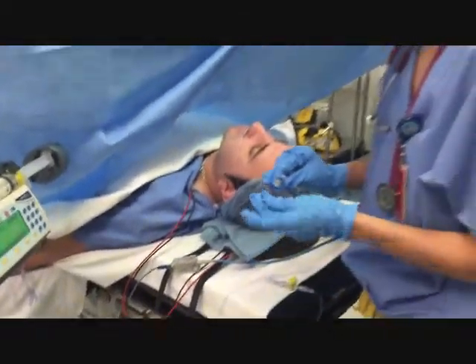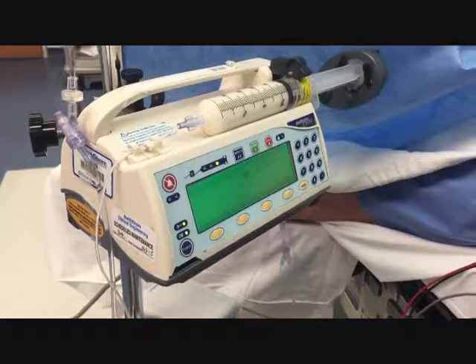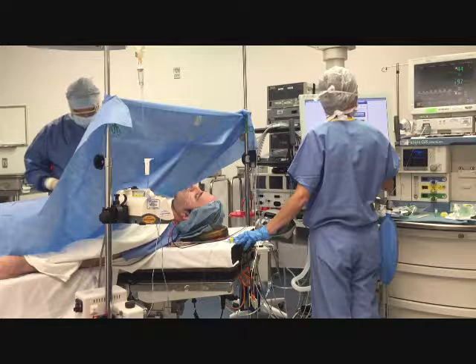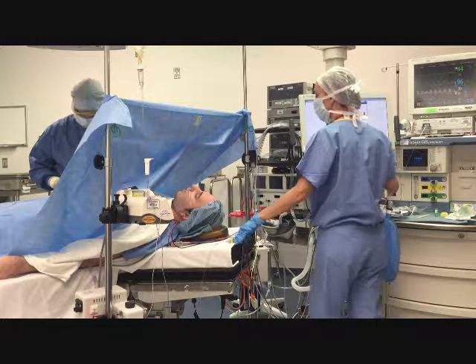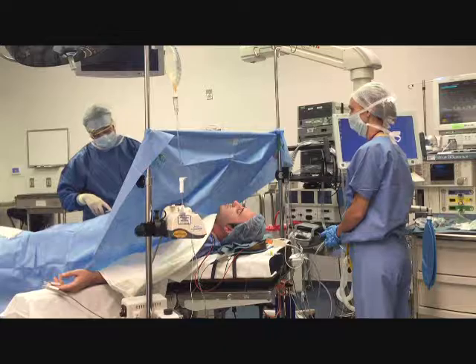An additional 50 mics of fentanyl has been given and a propofol drip is infusing at 75 mics per kg per minute. The surgeon makes incision without much response from the patient. He is occasionally lightly snoring with dampening of end-tidal CO2 waveform. Incision.